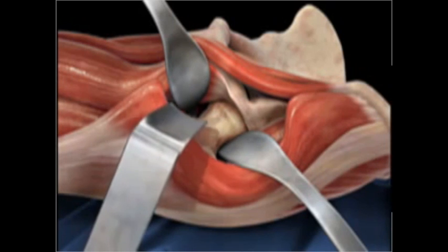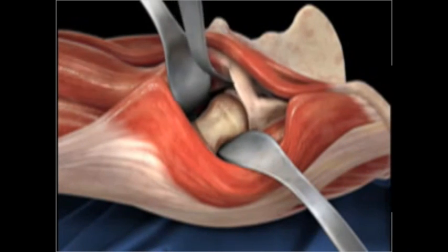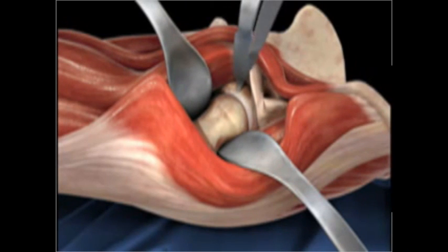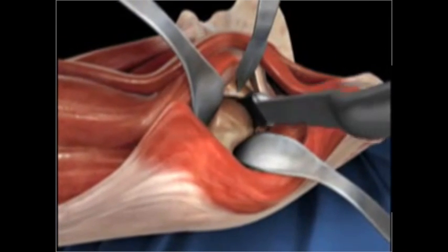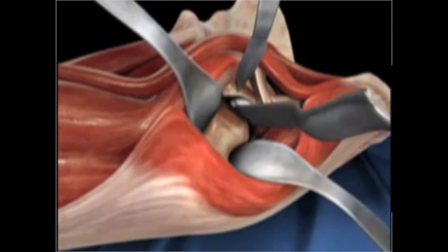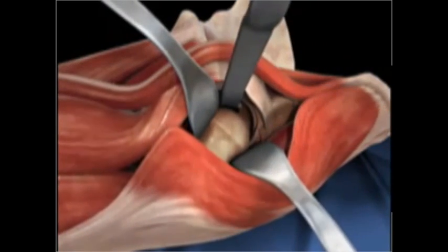So this video is going to show that sometimes what we do is actually dislocate the hip first by external rotation from that specialized table, that HANA table, and then we internally rotate it to get it back in the joint. That helps us mobilize the tissues a little bit further, and then we remove the head and the neck. So this is just a video of it, the hip being dislocated with external rotation.